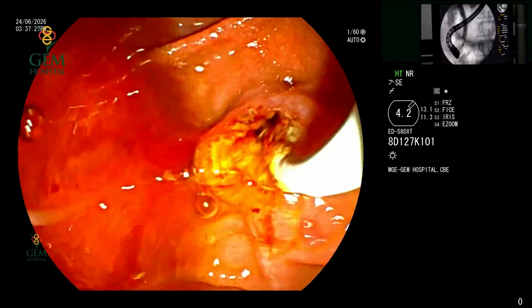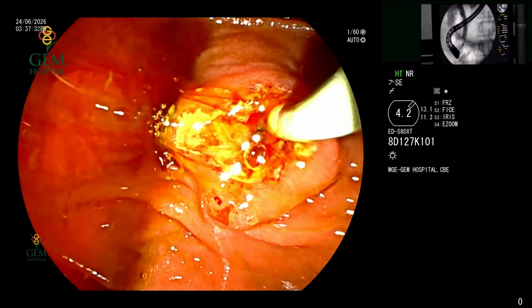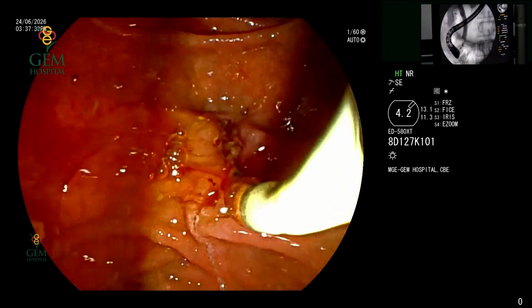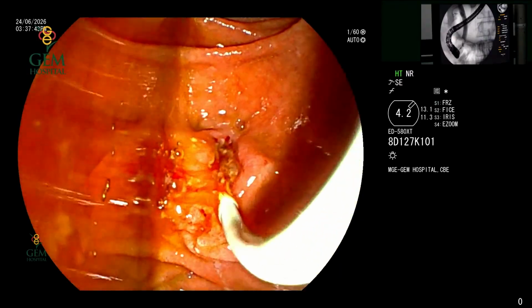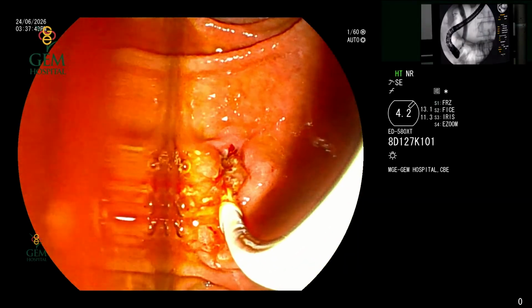We are again trawling out. A mild resistance, possibly secondary to the underlying stricture, but the balloon was freely coming out. We have inflated a 2.5 cc balloon. If you take a look at the cholangiogram, we can see the marker which actually shows the position of the balloon.